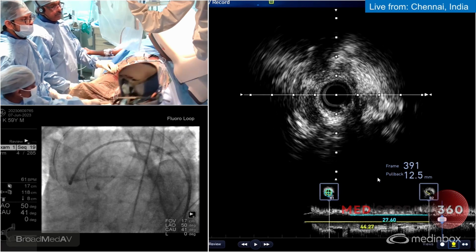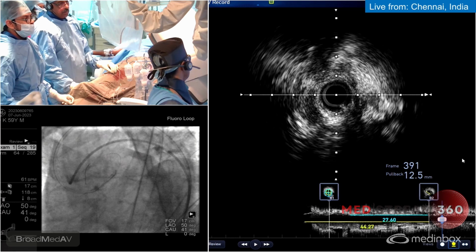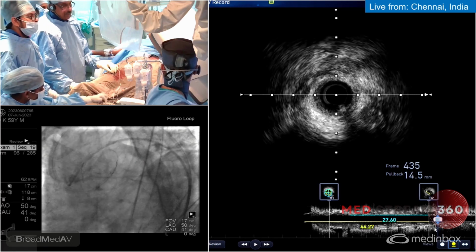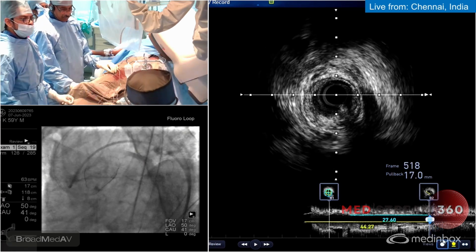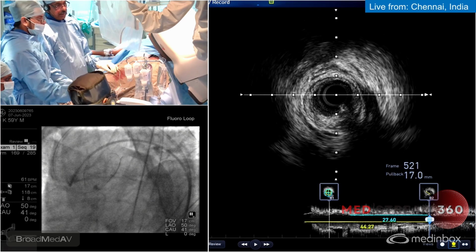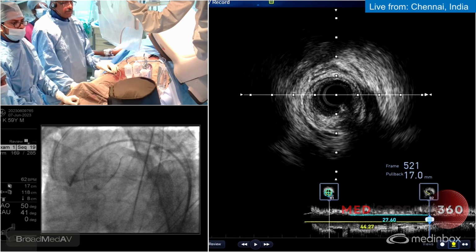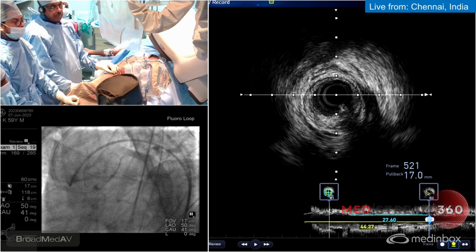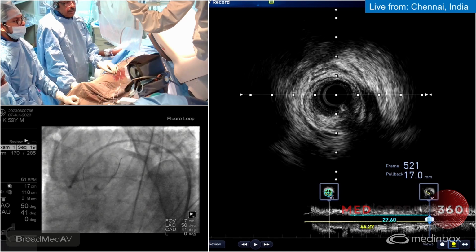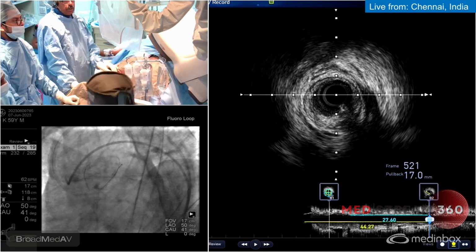Okay, so what we'll do is possibly, septal, okay. Yeah, it's about that septal area where I think the vessel looks better. So we have started IVUS pullback beyond the septal. Yeah. So what Nanda has told us is that there is a lesion which is diffuse in the LAD. The landing point seems to be a good point around that first septal. And we have a length of about total 30 millimeter from the ostium.